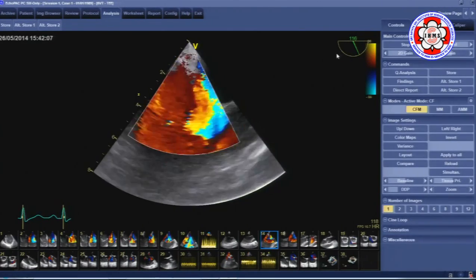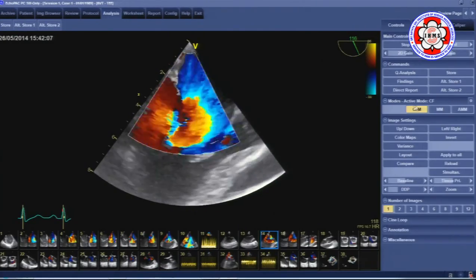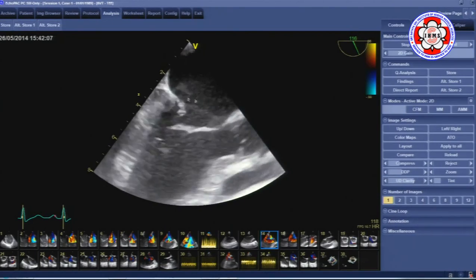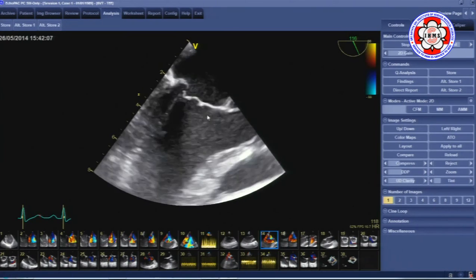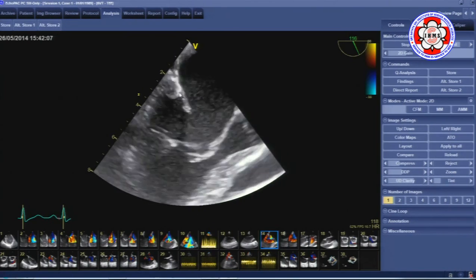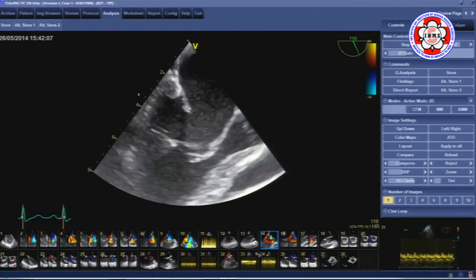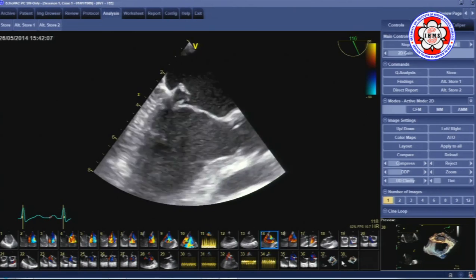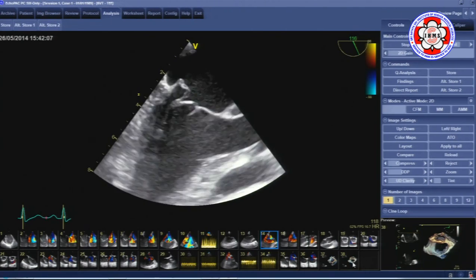Finally, the 120-degree long axis view is shown here. Removing the color, this shows A1, A2, and then P3. So you've got a 0-degree view, a 60-degree view, a 90-degree view, and a 120-degree view — that's four. And then you have a short axis view if you go into the stomach — that's five. So it gets very complicated, and surgeons really don't have the time or interest to see all of these views.